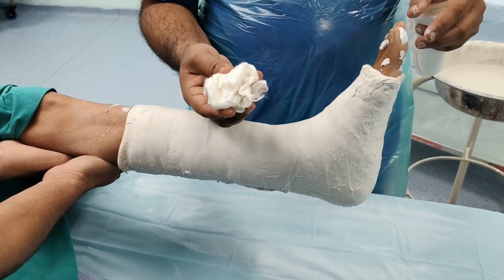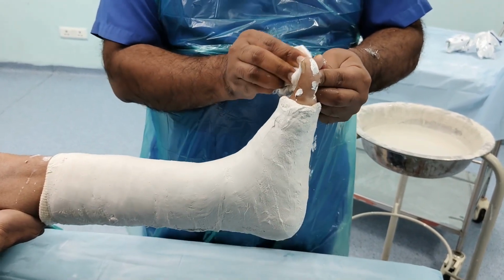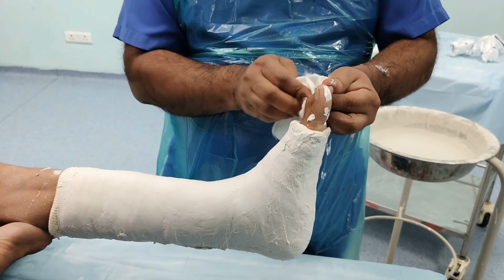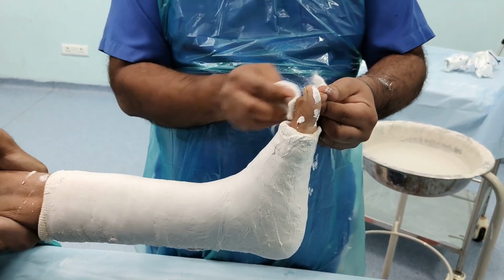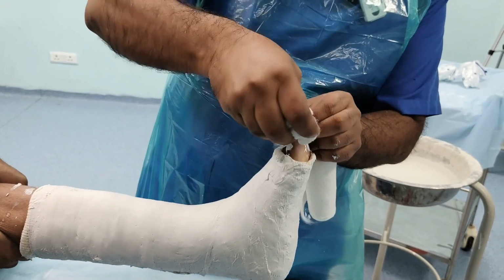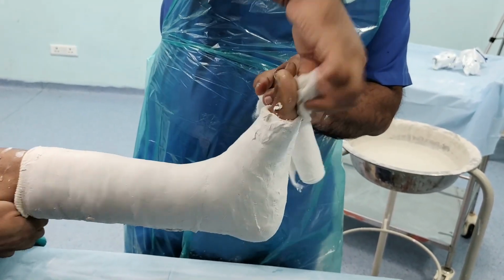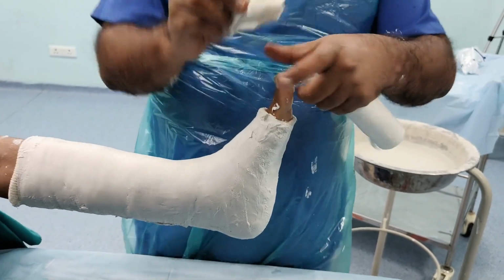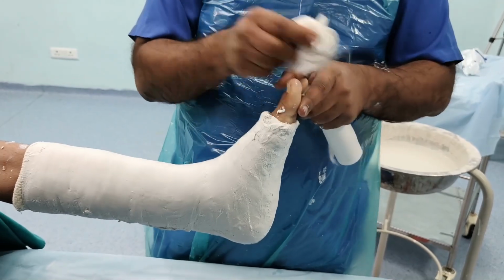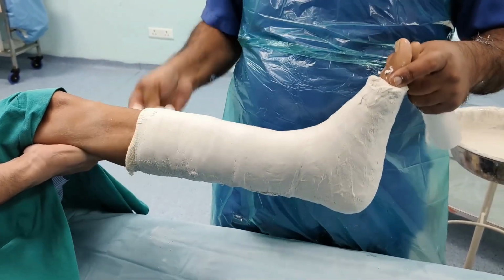calf. One more tip which is essential is, don't leave the limb messy. You take some cotton, soak it with water and clean the limb. This cleaning is also important. Means you are applying a plaster, this is your responsibility to clean the limb. Don't just tell your juniors or some other person to clean it, because this cleaning will reveal the capillary filling also. Means you can just appreciate the capillary filling of the toes if the toes are clean. So clean them, clean the calf, the upper end, and definitely keep the things tidy.